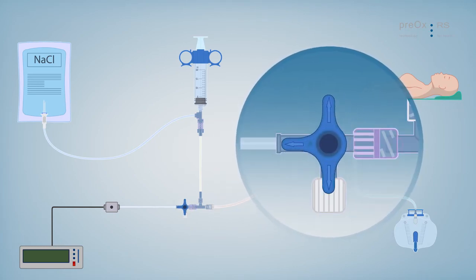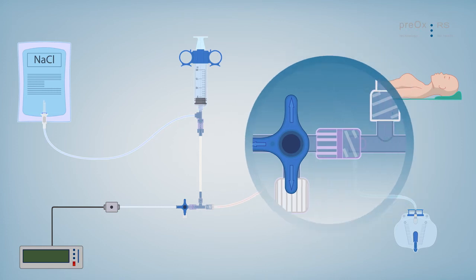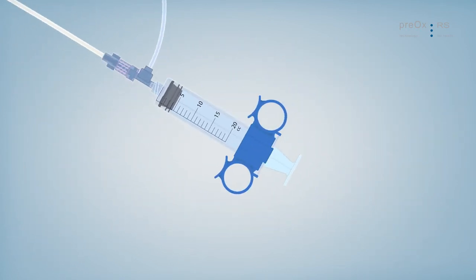Now close the three-way stopcock. Fill the syringe up to 20 ml by pulling back the plunger.